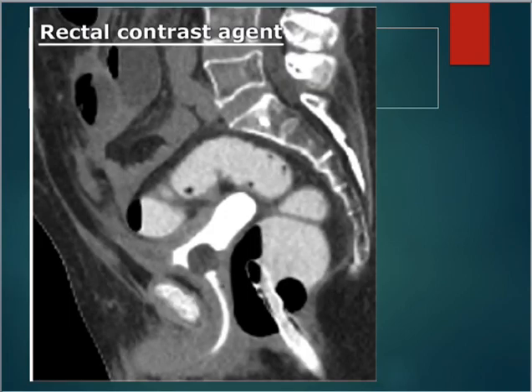This is a rectal contrast scan, so you can see here the enema. We still use an enema tip. It's inserted. You've got the air and then the contrast that they use to check the rectum, see if there's anything going on, perforations.